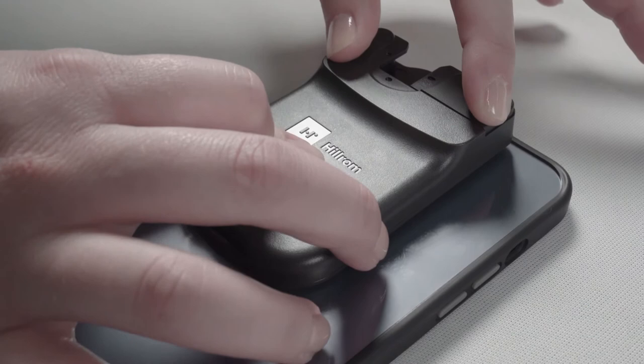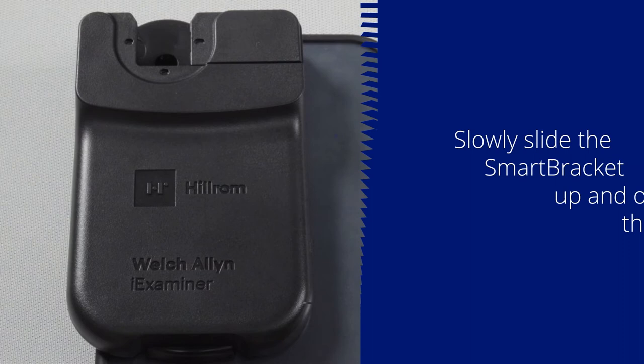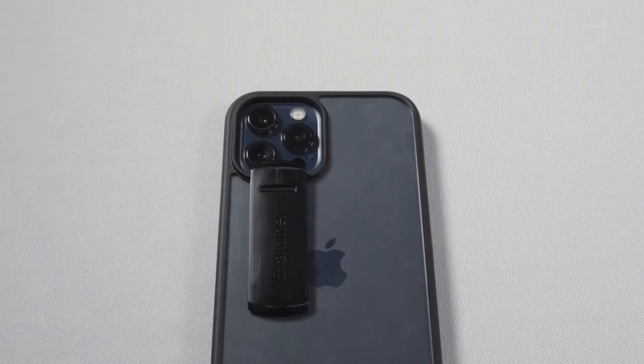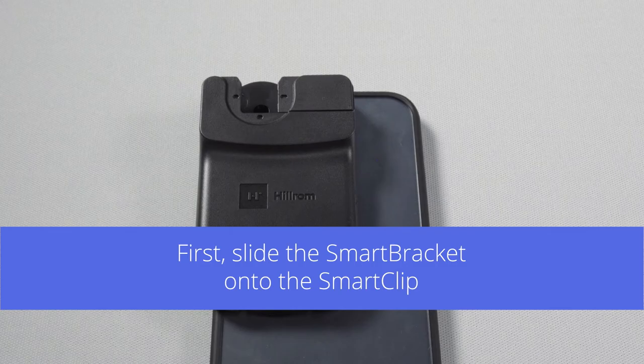Once secured, slowly slide the smart bracket up and off of the smart clip. Firmly press the smart clip down onto the case again to help ensure it has fully adhered to the case. To attach your smartphone to your Welsh Allen device, first slide the smart bracket onto the smart clip on your smartphone. Then slide the smart bracket clip onto the instrument in any of four directions.